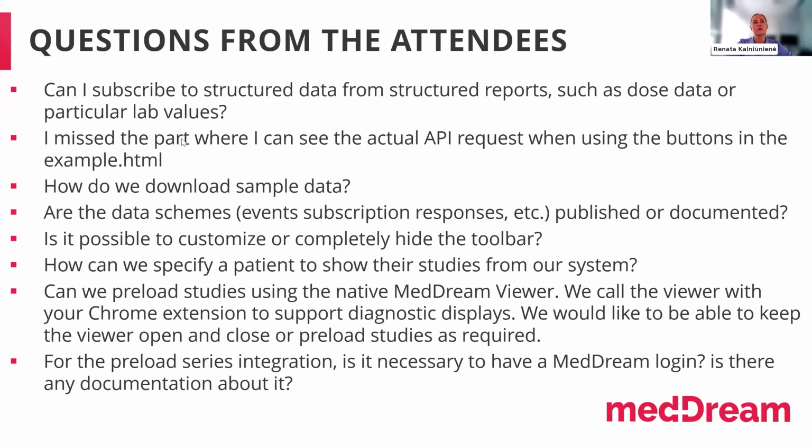Okay, thank you. Another question, how do we download sample data? Yes, there was also a link for the sample data in the demo PDF document, the instructions on how to set up this demo. There you will find all the links to the communication API demo and to the sample studies which we use for this demo, and so on.